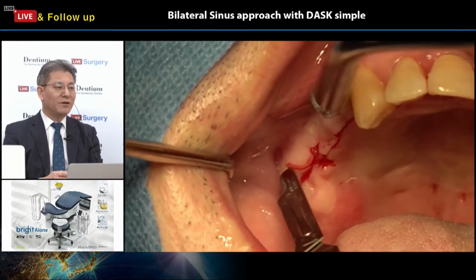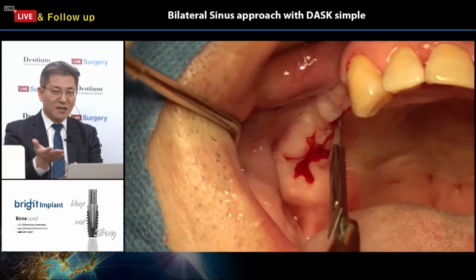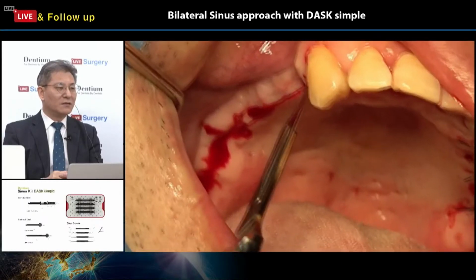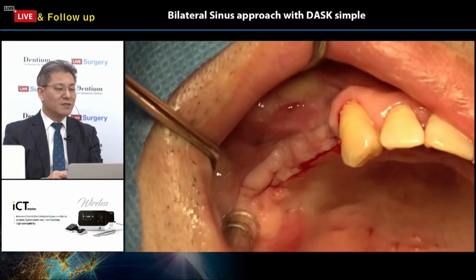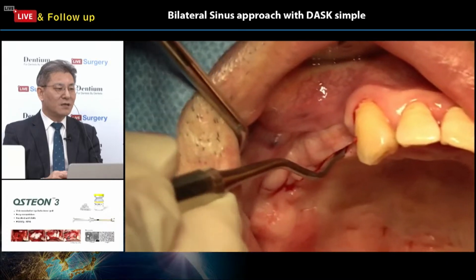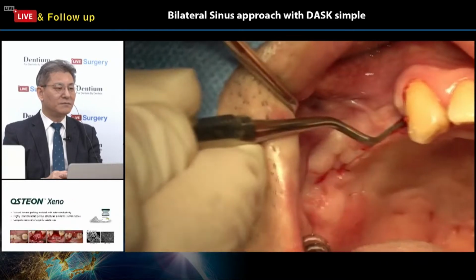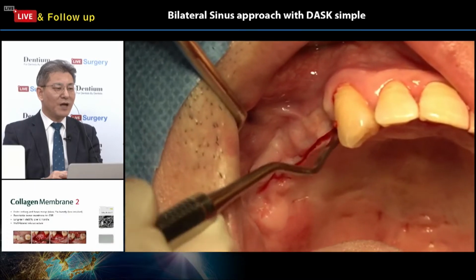Okay, the posterior portion, Dr. Chung is preparing to make a semilunar style. Okay, the cross-checking, making assurance of the crestal incision, and now the flap reflection procedure started. Now he is using the back action chisel.